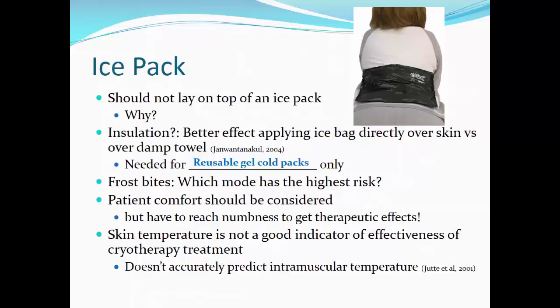The comfort level of the patient is very important, but remember that we have to go through the 4 sensations of cold to reach numbness. Remember CBAN? Cold, burning, aching, numbness. You need to make sure that you are reaching numbness, which will take at least 20 to 30 minutes of treatment. Skin temperature is not a good indicator of the effectiveness of cryotherapy treatment programs.